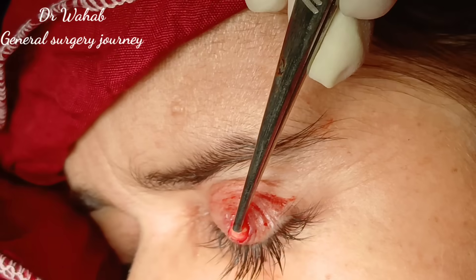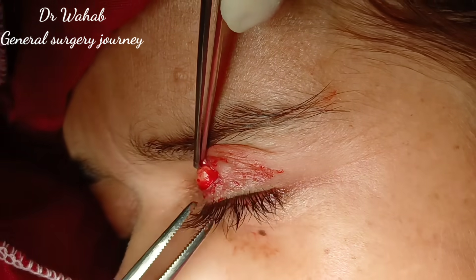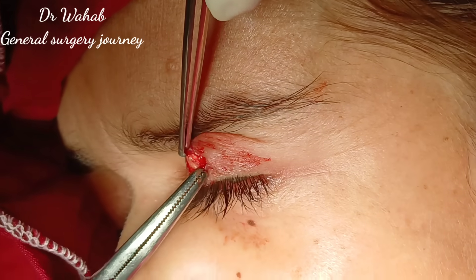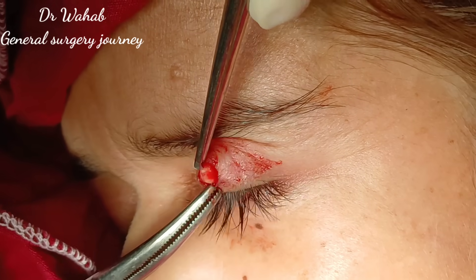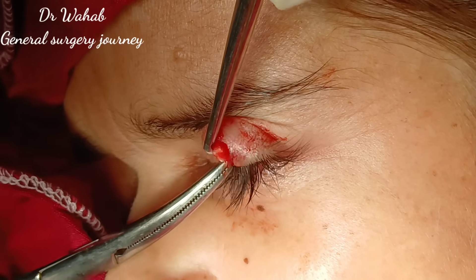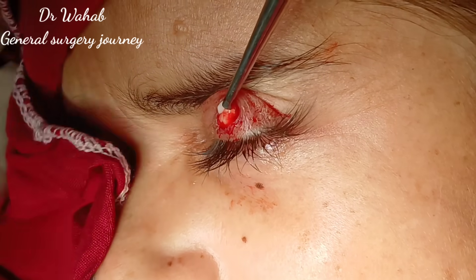We are now carefully identifying and excising the remaining cyst wall and capsule to reduce the risk of recurrence.